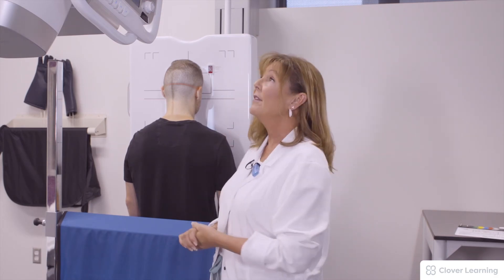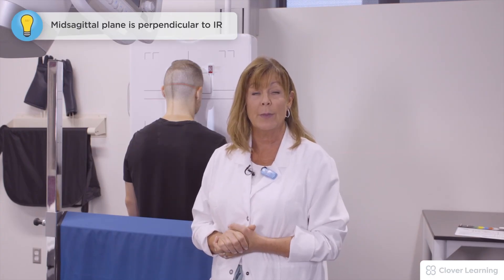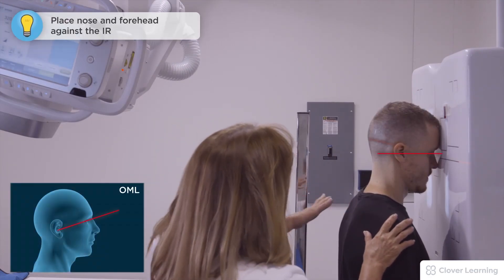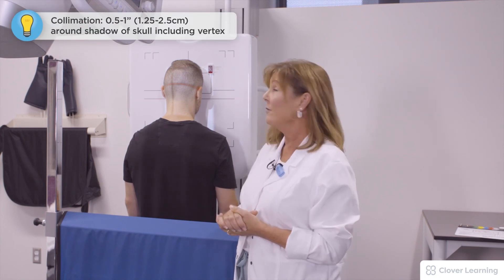For the PA Axial view I have my patient standing at the upright bucky. I have a 15-degree caudal angle on the central ray. The mid sagittal plane is aligned to the board and forms a perpendicular plane to the IR. My patient's nose and forehead are rested up against the board. The central ray exits out through the nasion. I have a half an inch to an inch collimation around the shadow of his skull. I have placed a right marker on the right side.